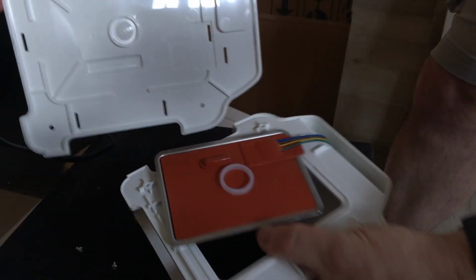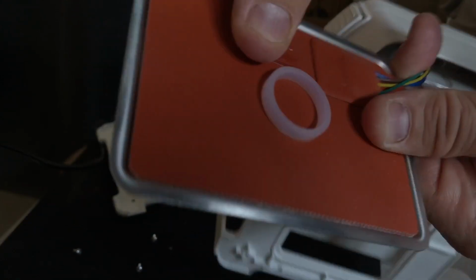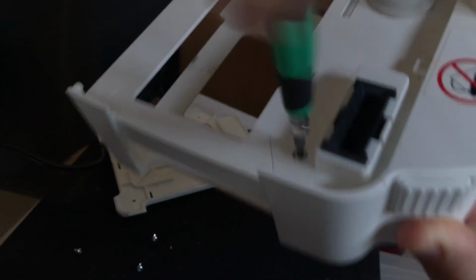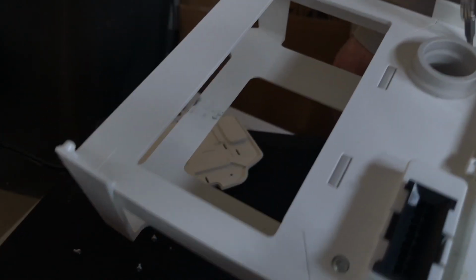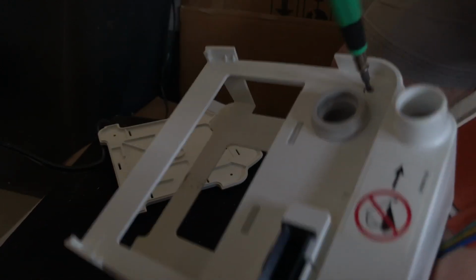Okay, that's it. Basically, we've got a heating pad, which is right here. You can see it's only got 4 leads going to it, which begs the question, why did they need this huge port here with so many components? I guess maybe they have other models and they have to interface to other things, so I don't know. Let's open this up and see what we got.